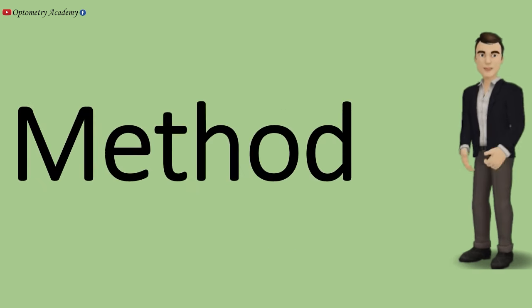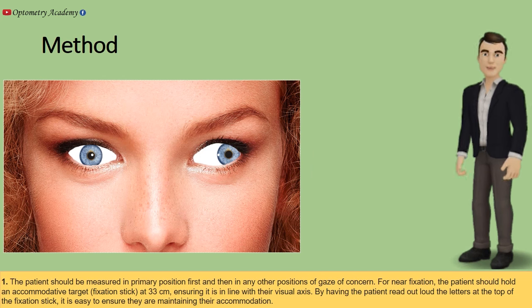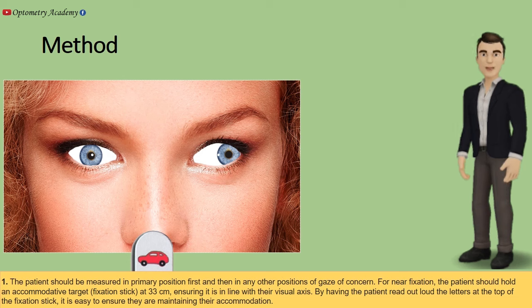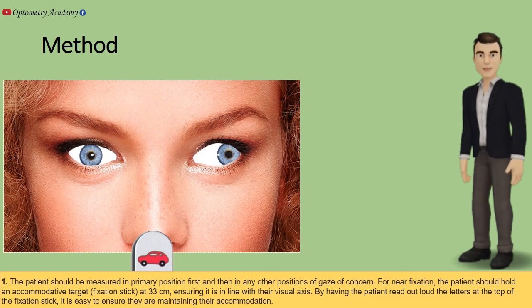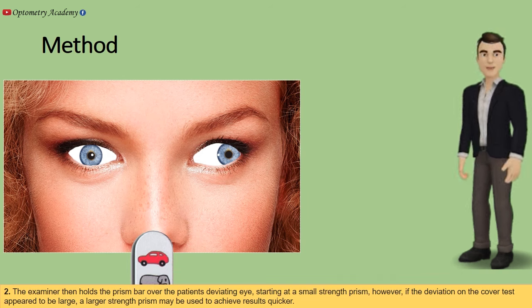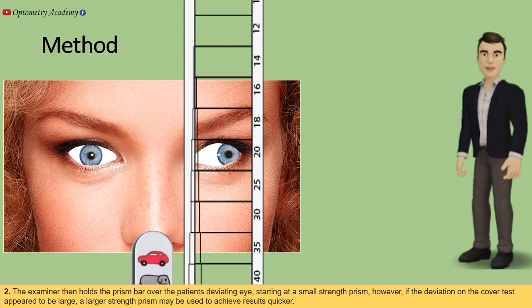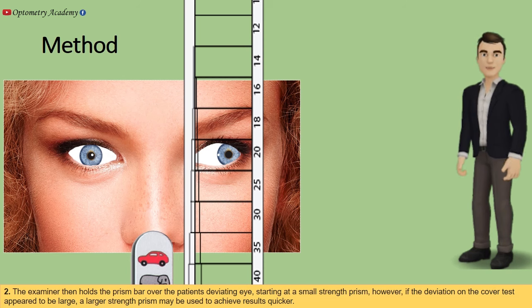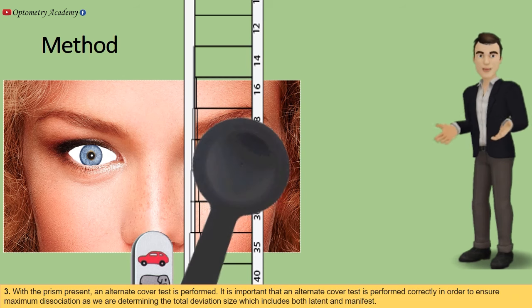The patient should be measured in primary position first, then in any other positions of gaze of concern. For near fixation, the patient should hold an accommodative target at 33 centimeters, ensuring it is in line with their visual axis. By having the patient read out loud the letters at the top of the fixation stick, it is easy to ensure they are maintaining their accommodation. The examiner then holds the prism bar over the patient's deviating eye, starting at a small strength prism. However, if the deviation on the cover test appears to be large, a larger strength prism may be used. With the prism present, an alternate cover test is performed.